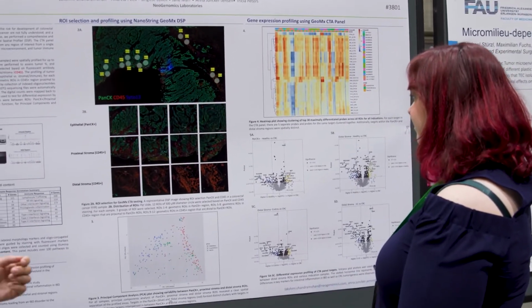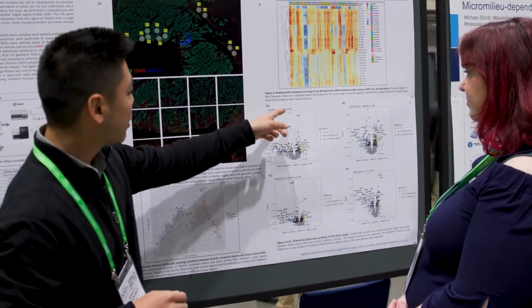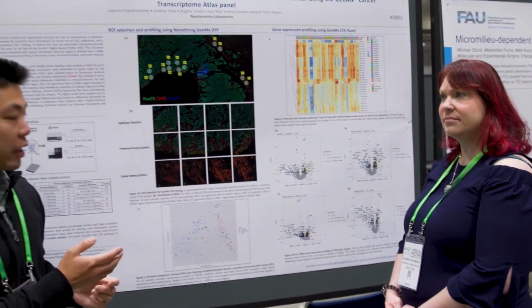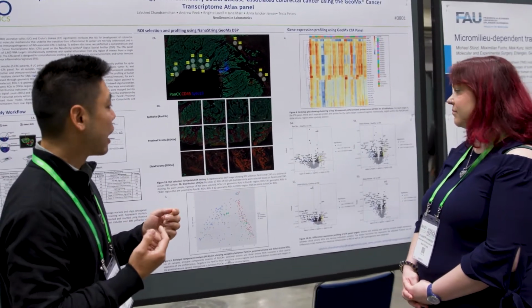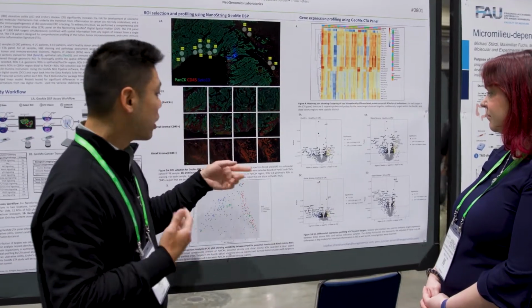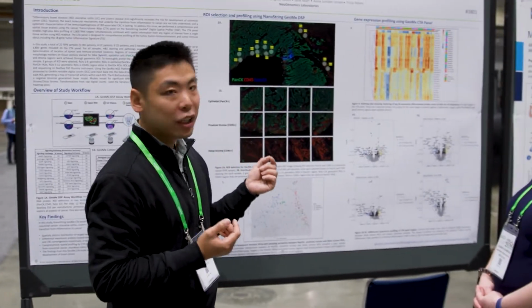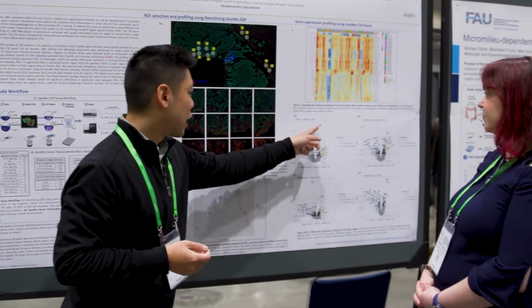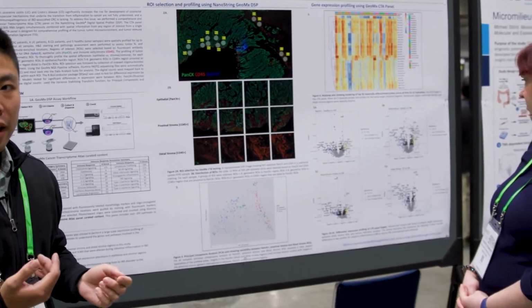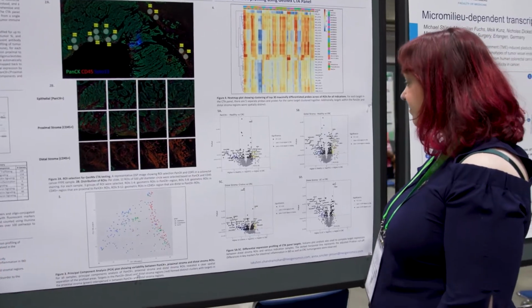And then from our volcano plot, very surprisingly, we found that there were a few markers that were CRC positive and highly expressed that were differentiated from either healthy patients or Crohn's disease. One of the markers that we're really excited to follow up is SOX9, which is present in basically all of the CRC. It's very highly expressed, and we're really excited to follow that up.